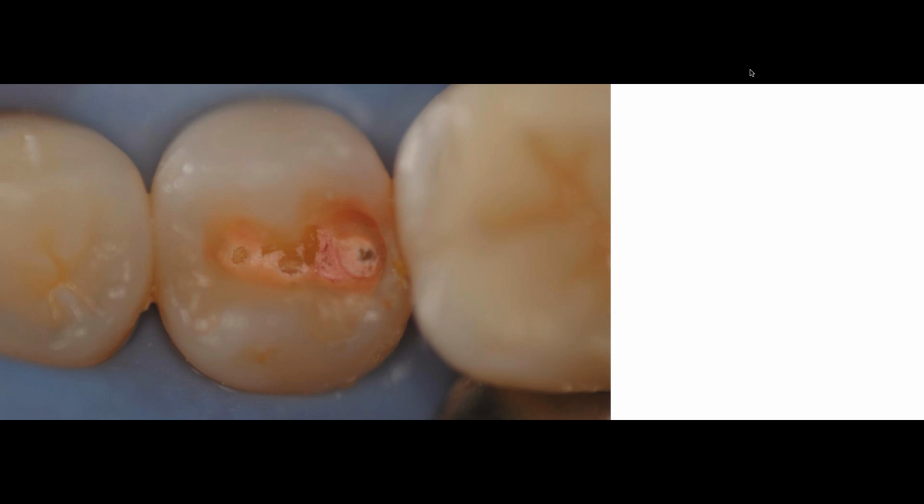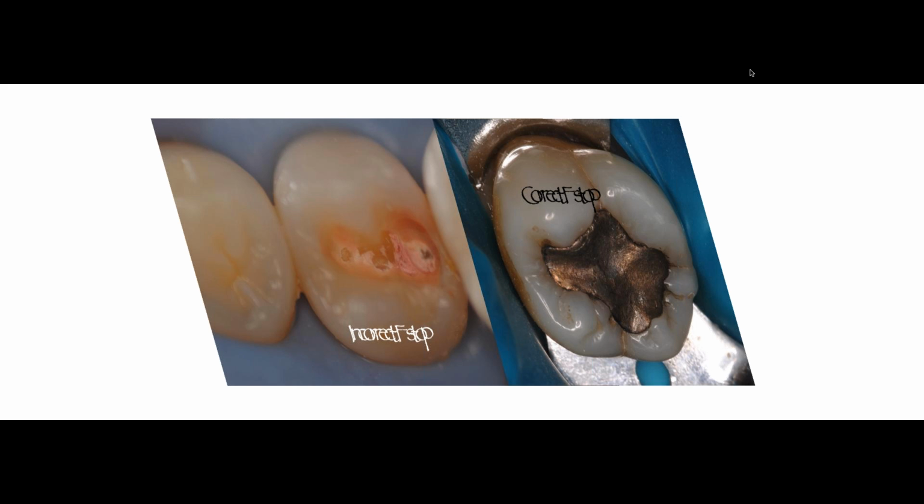of that cavity. But if you look at tooth number 3 and you look at tooth number 5, they're both out of focus. If you look at the actual tooth number 4, on the buccal, it's out of focus. On the lingual, it's a little bit more in focus, but it's still out of focus. So the only area that is actually in focus is that spot on the pulpal floor, on the distal pulpal floor. So this photo, what's wrong with the photo? The f-stop was wrong.